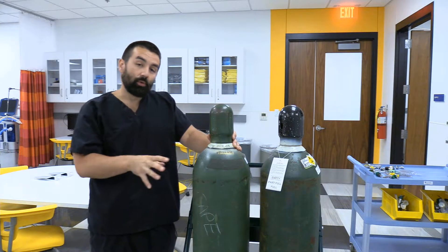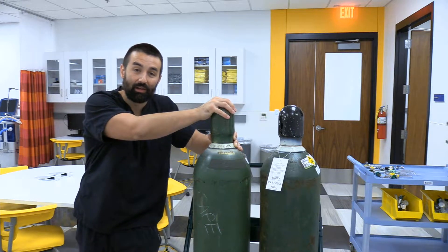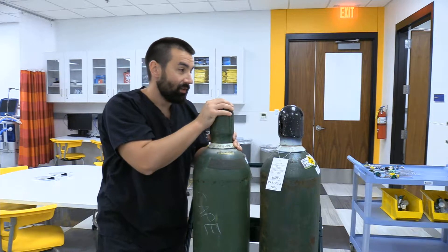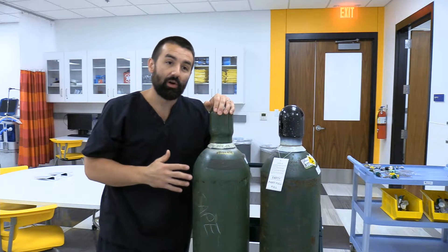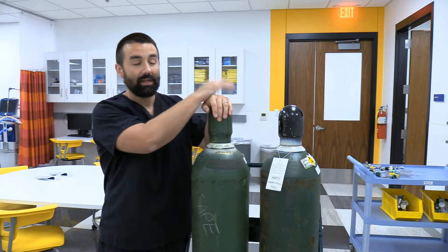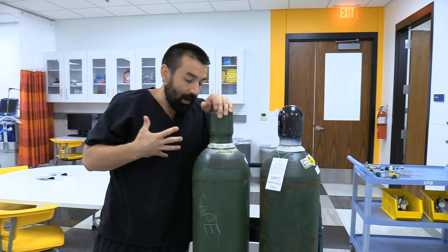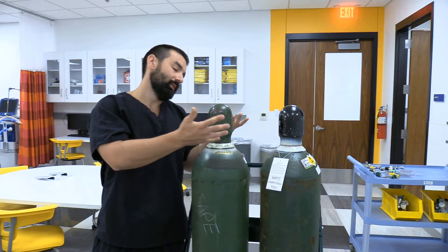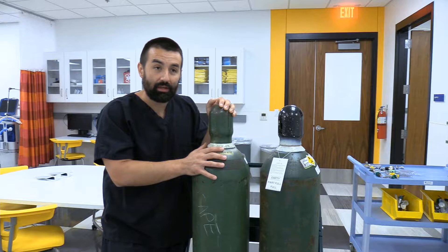If you're having to hook up anything to a 50 psi source not coming from the wall — getting a big H cylinder for oxygen — something really bad probably happened. You may need to use this tank to back-feed a part of the hospital hit by a disaster, or you had a gas leak and need to isolate things. The most common incident in my experience for hooking these up is using heliox tanks — a brown and green tank.